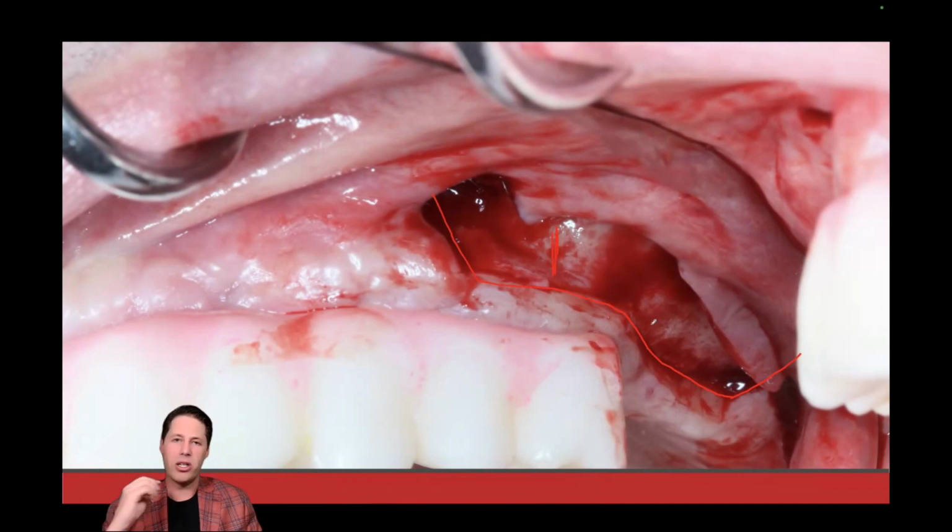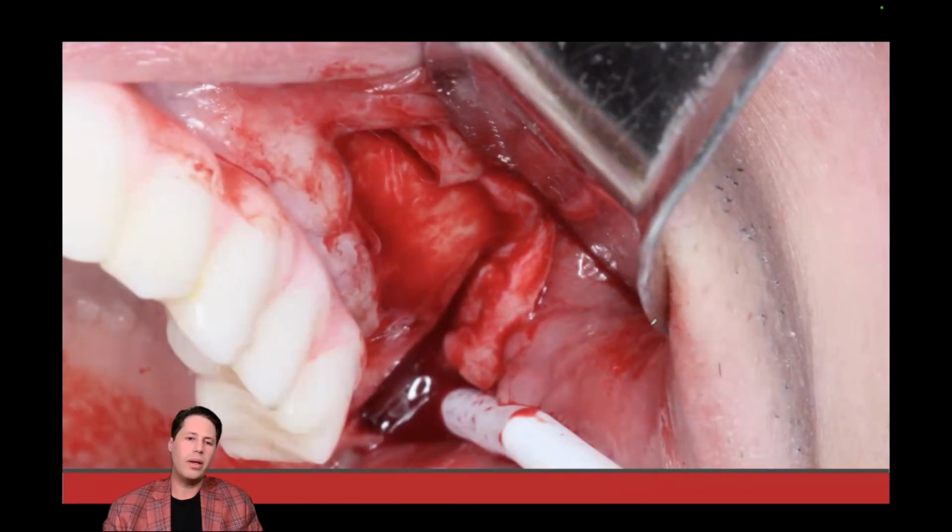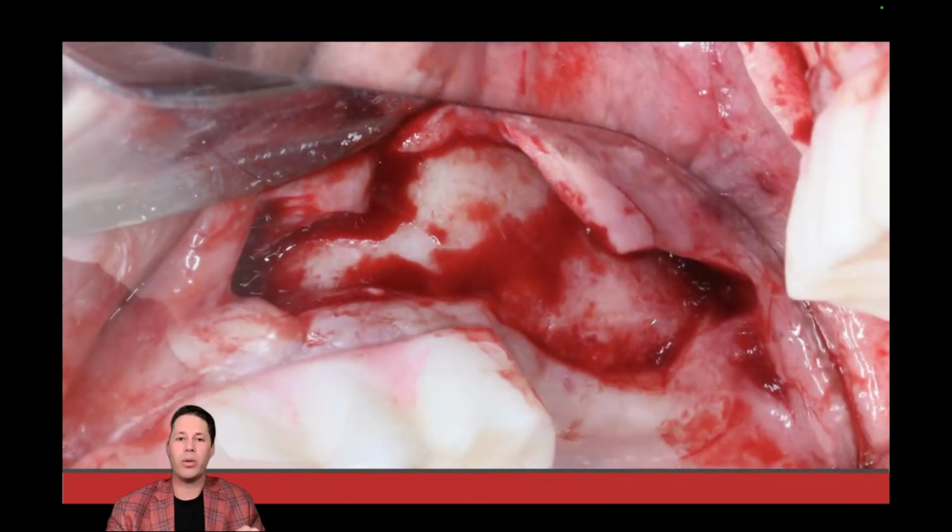The one vital structure we need to look for and be mindful of is the anastomosis between the PSA and the MSA. It's going to be that vital vascular structure we want to avoid. In this case, it was not visualized on the CBCT, so we really don't have much to worry about. Here again is just a different view. Sometimes these photos can be a little bit more difficult to take, but I just want to give you an idea of what that maxillary sinus looks like and give you some different views prior to opening the window.